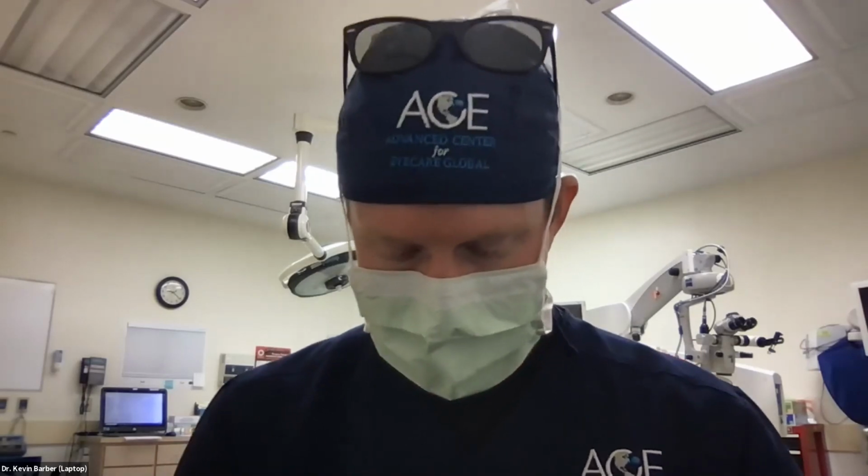It creates a lot more space. The only reason I wouldn't do it is if I'm worried there's going to be a lot of corneal edema, or maybe you're a learning phaco surgeon and you're still working on reducing corneal edema and it could obscure your view a little bit. That's really the only counterargument for not doing the phaco first, but it is certainly easier, and obviously you're not going to cause damage to the anterior capsule, or much less likely to if you've already done the cataract and you have the lens implant in place.